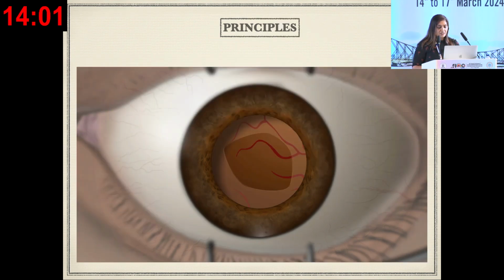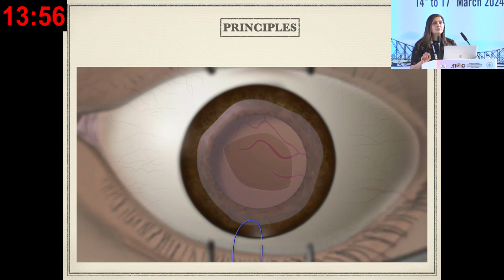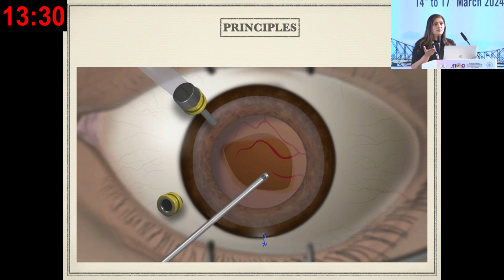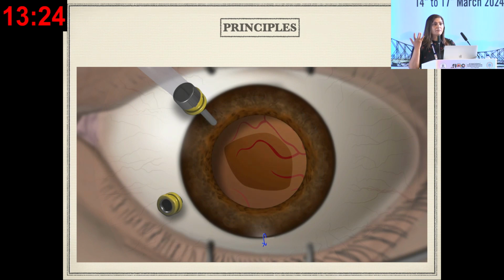The second thing is, when you have a rent out there, you need to take a suture at the corneal incision first, and then you go ahead from the side port incision and use the anterior chamber fluid maintainer. Now you need to go ahead and do a vitrectomy. Whenever you have a very big posterior capsular rent, the ideal thing to do is a pars plana vitrectomy, because you need to cut down the entire vitreous from behind the rent. You don't want that to come up much more anteriorly.